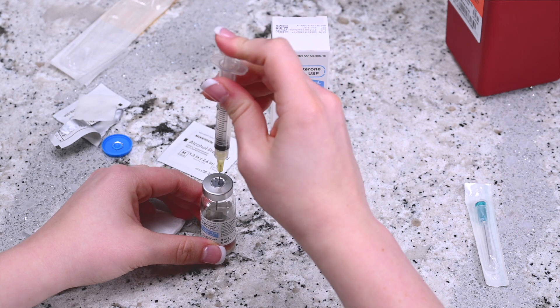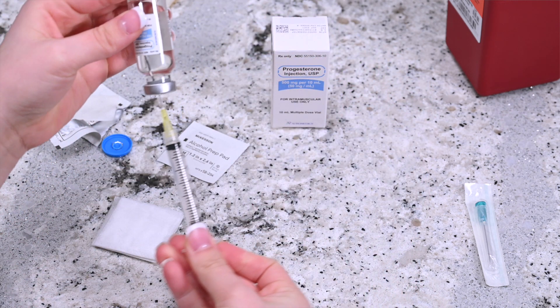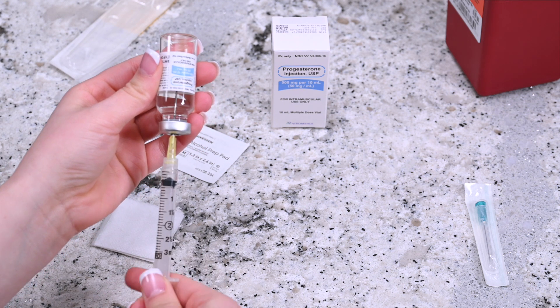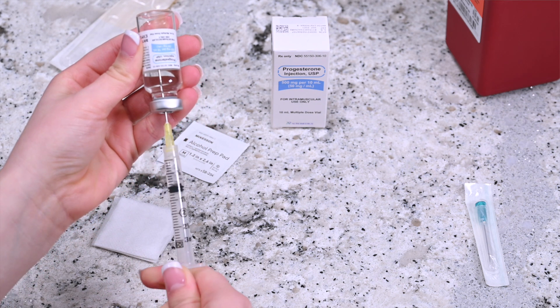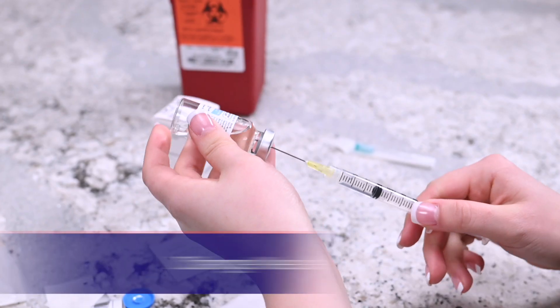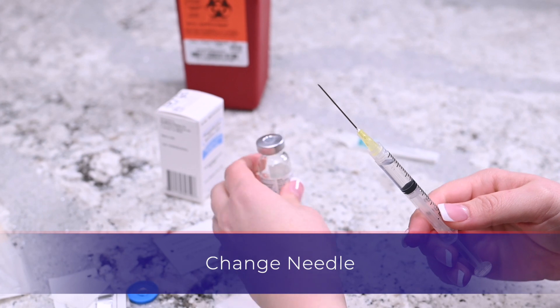Invert the syringe so that the vial is upside down but still attached to the syringe. Pull the plunger until the correct dosage of medicine enters the syringe. Take the needle out of the vial and replace the cap.